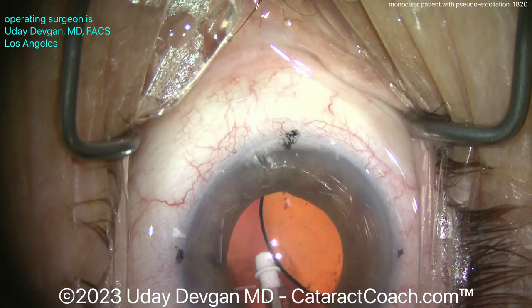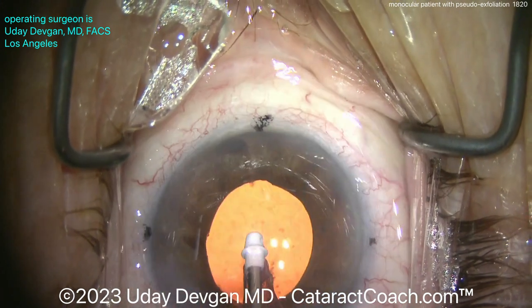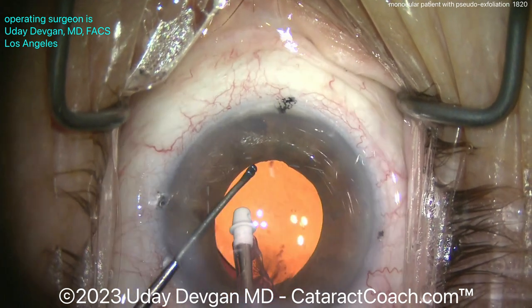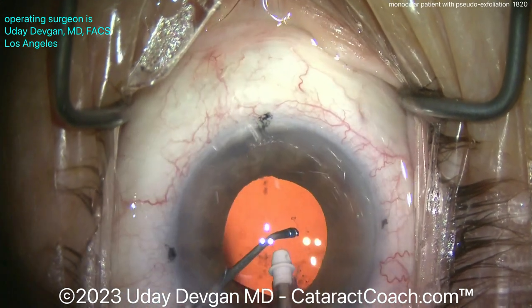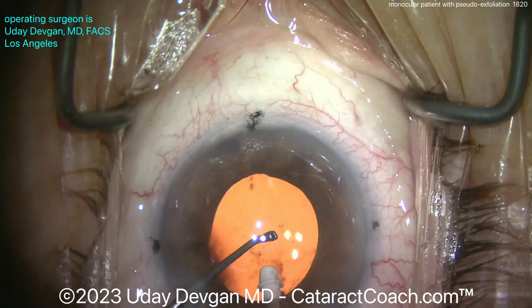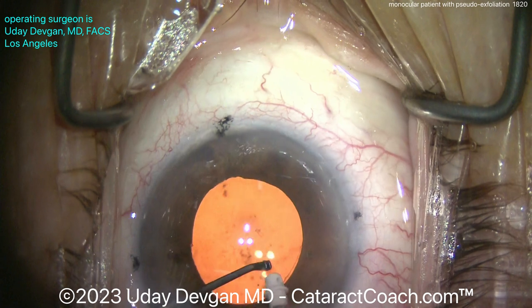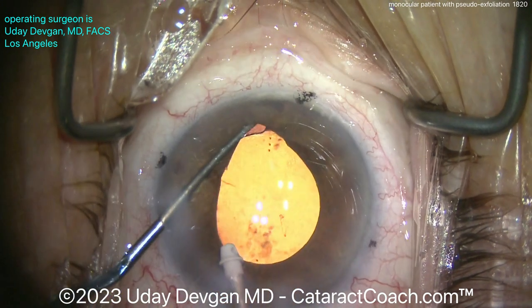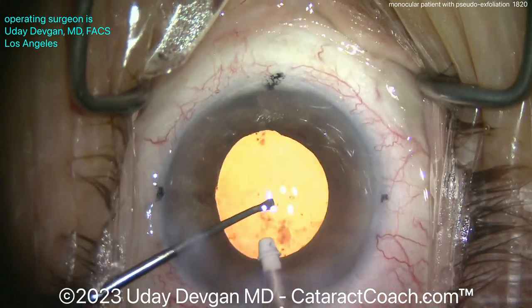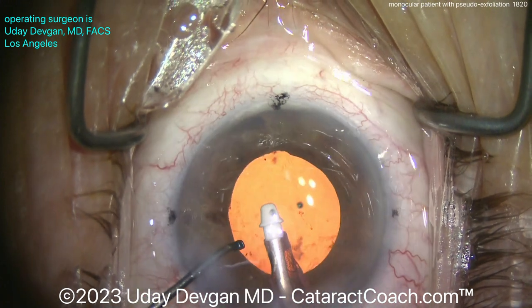Going behind the optic, taking out all the viscoelastic that was behind there — it should come out cohesively in one big clump, just like it did. Now let's get this toric lens rotated into the correct meridian, lifting up the iris a little bit to see where we're at. There are little tiny fragments of lens material that went through the zonular support behind the posterior capsule at the anterior hyaloid face — those fragments will go away in the inflammatory cascade; the patient will just get steroids in the post-op period.